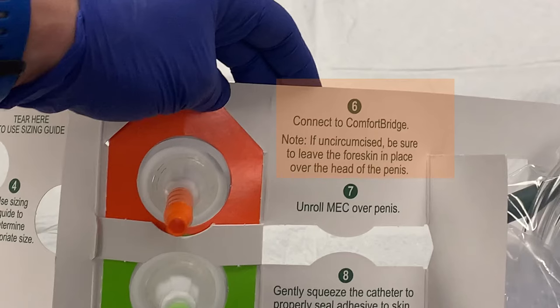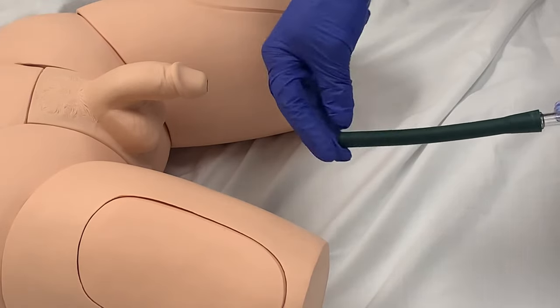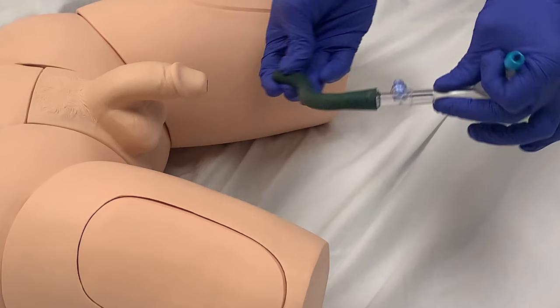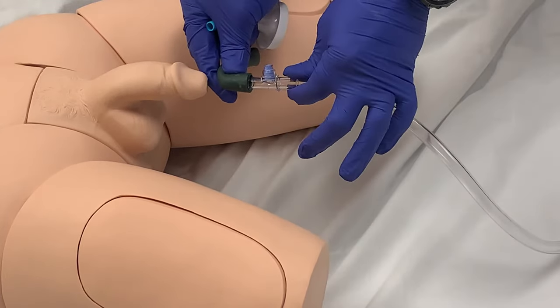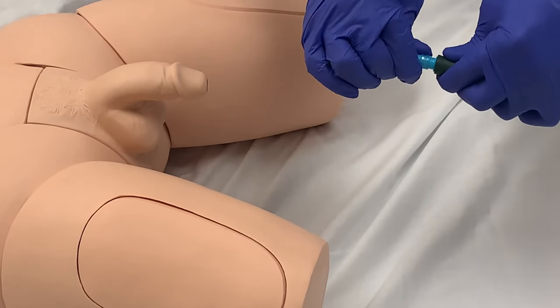Step six is to connect the Comfort Bridge. This is the name of a flexible tube that bridges the catheter to the drainage bag tubing. It provides a much more comfortable experience for the patient, as this material is able to more easily adapt to patient movement. Condom catheters that were previously utilized had rigid tubing connected directly to the condom catheter, which was potentially very uncomfortable and also caused the catheters to more likely be dislodged as the tubing fought and pulled against the patient's movement.